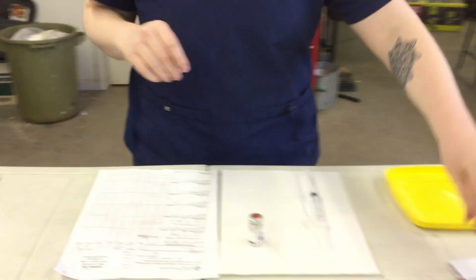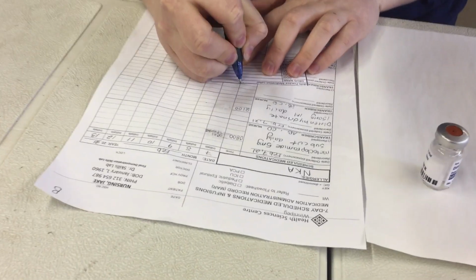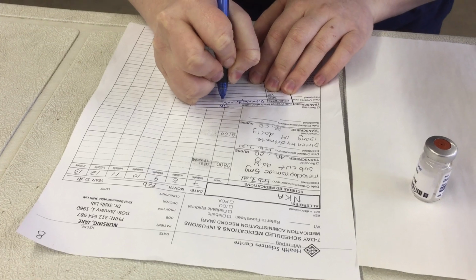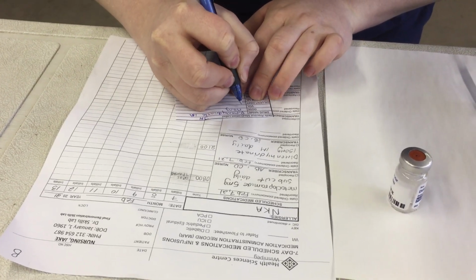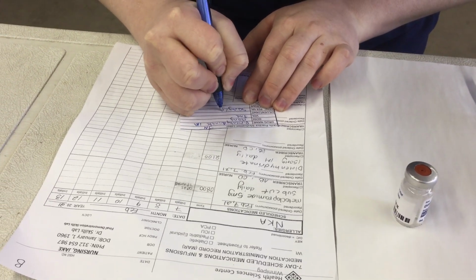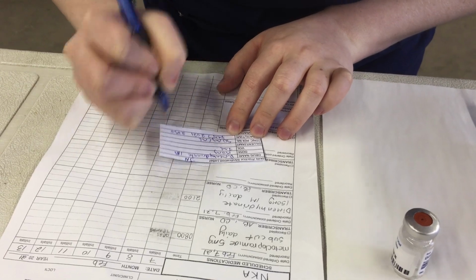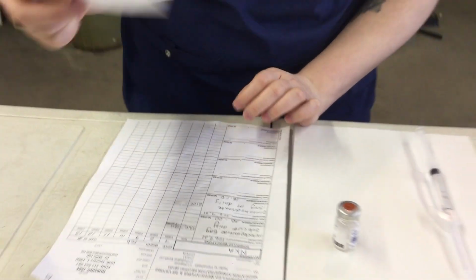So once I've done that, I'm going to label my syringe. So we have Jake Nursing. The drug is dimenhydrinate and it is intramuscular. The dose is 150 milligrams. The volume is 3 mLs. The concentration is 50 milligrams per ml. The date, so it's February 7th, 2021, and it is 2030, and TPUMSN2. So I would immediately label my syringe here.